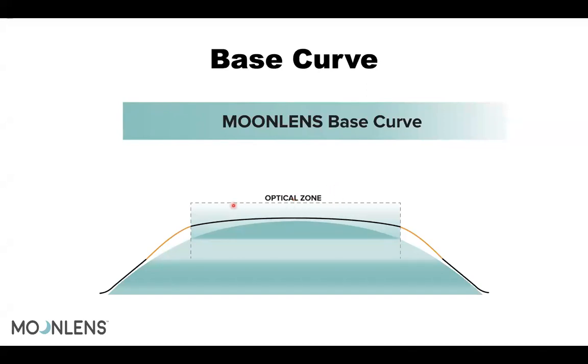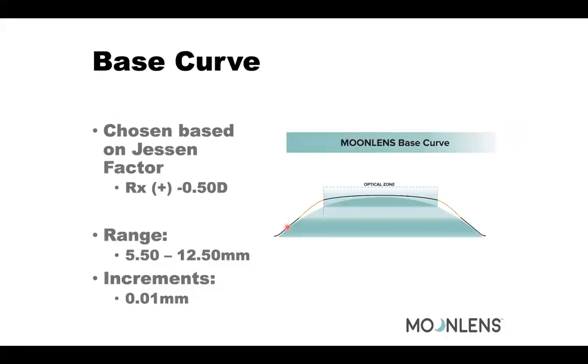So just remember that the purpose of this area is to create the molding of the cornea and to have the correction of the cornea made with this. This is going to create a positive pressure down here, and a negative pressure is going to be created on the reverse curve. But it is a positive pressure down here, and that's going to make the epithelial cells redistribute and mold that cornea with the base curve. That's the functionality of the base curve.